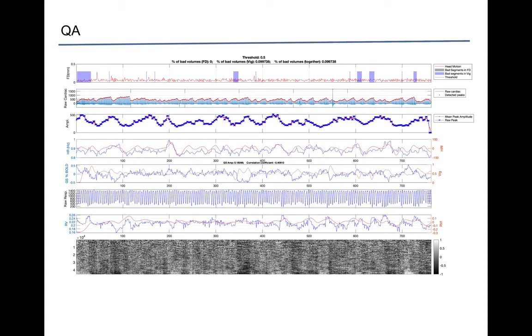On the bottom row here we have the gray plot for the signal intensities, and you can align them and see how the time series intensities change when there is motion or other things. Again, that would be a quick way of evaluating your data at one glance.